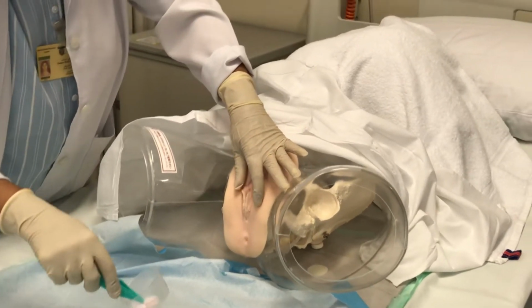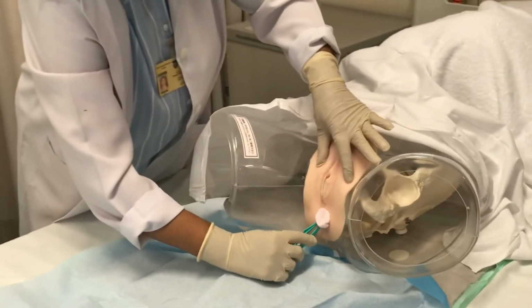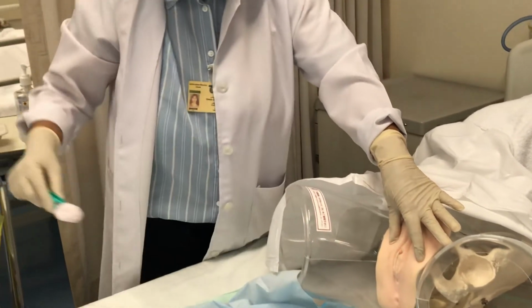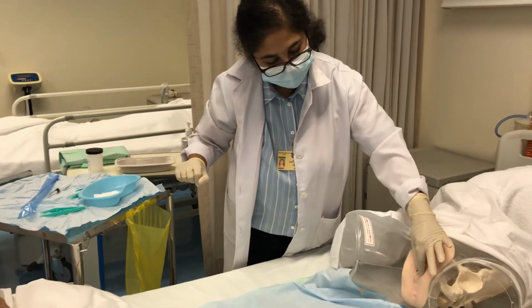And then the final one, including the clitoris. Clitoris, down. Throw that out.